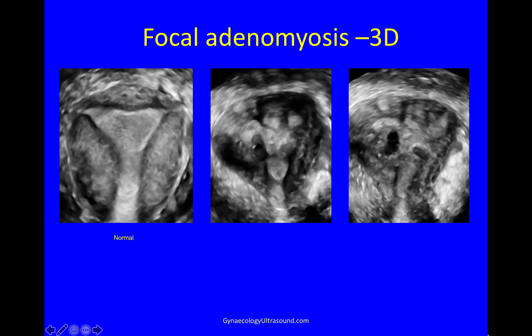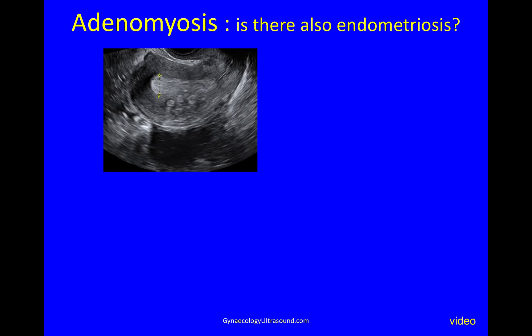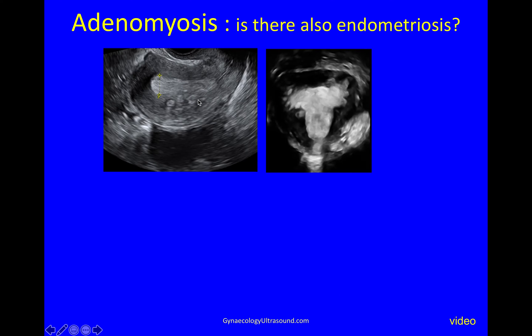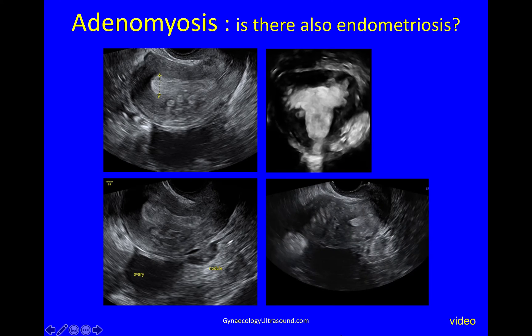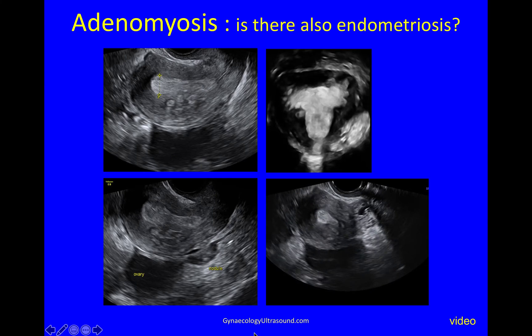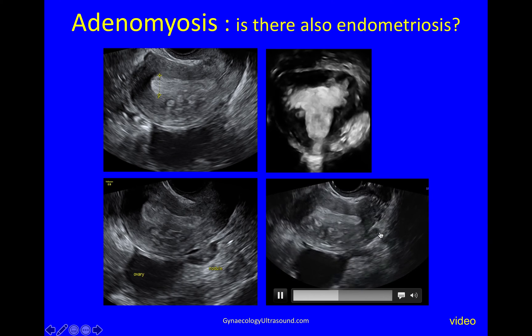When you see adenomyosis you have to think: is there also endometriosis? In this different case you can see islands of endometrium in the myometrium, and on 3D the out-budding of endometrium into the myometrium is clearly visible. This patient also has an ovarian endometrioma, a nodule of deep endometriosis in the bowel, and deep endometriosis in the ligaments — so adenomyosis in the myometrium, ovarian endometrioma, and deep endometriosis in the bowel and ligaments.